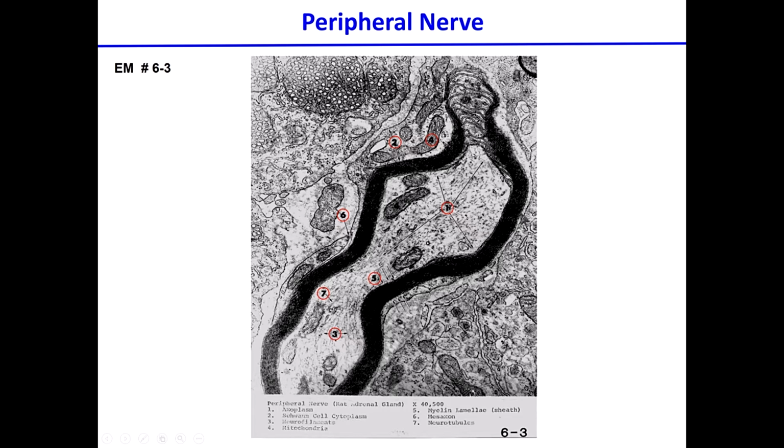They are not pointing to the outside, okay? So this is simply the inside of the axon, and there is the axoplasm, all right? There is mitochondria in there. There is a number of filaments. There is actually a neurofilament here that has been caught, and it's slightly thicker than the other filaments inside the cell.